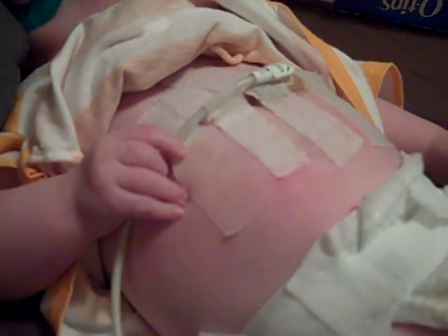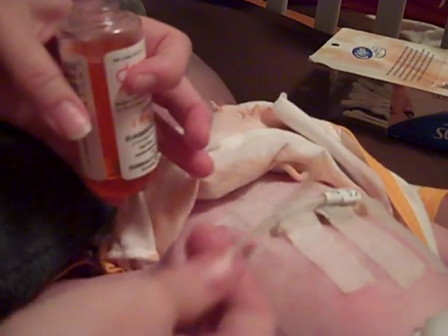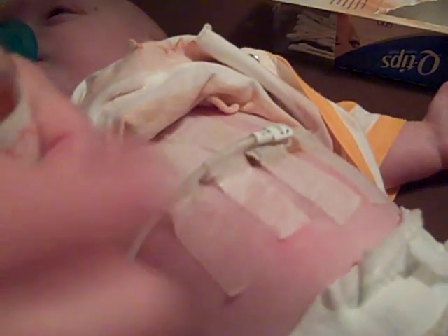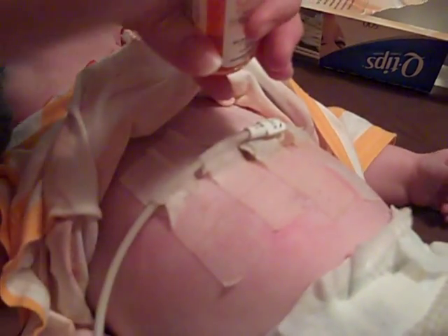So, like I said, the trick is to try to keep a still baby while you're doing this, and also make sure he doesn't want to yank his own tube out, which sometimes that's a challenge. So anyway, you just put this stuff on it, and you just give it a minute. It soaks right in, and then it actually just lifts right up. So I'll show you how that works.